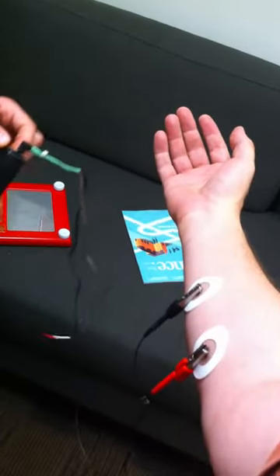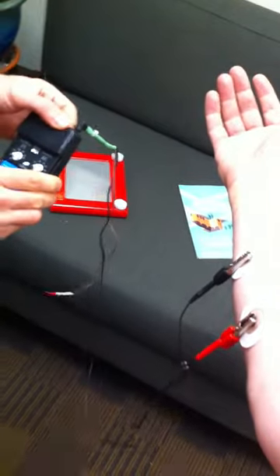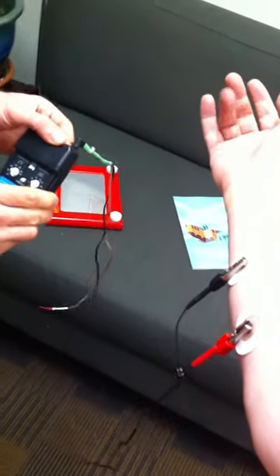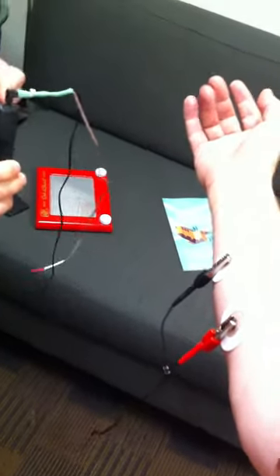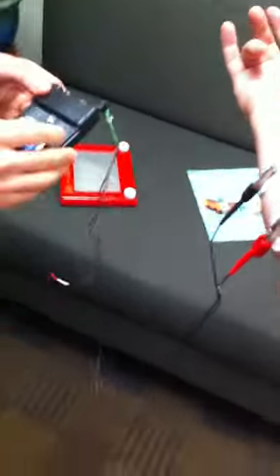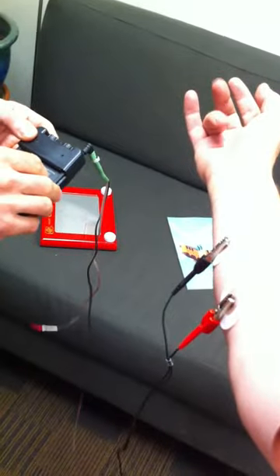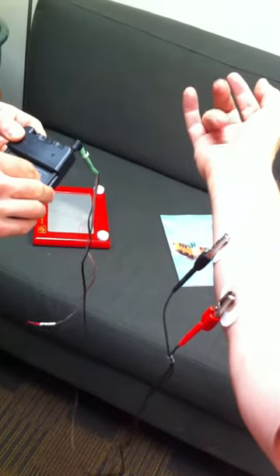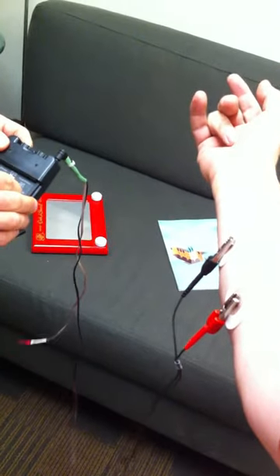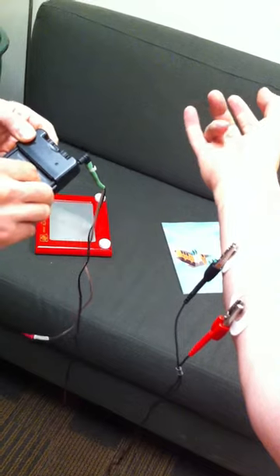I'm going to turn up the amplitude until we start to see some twitching. There we go. That didn't hurt. So that's setting 3. Yeah, okay. Increase the pulse rate. Wow, that's hard to fight back.